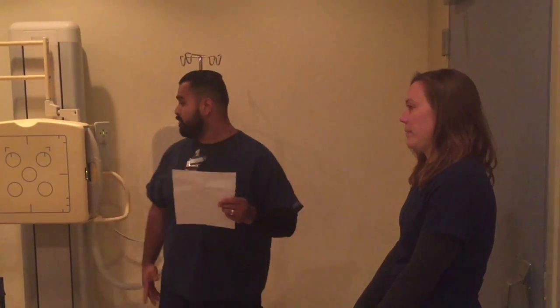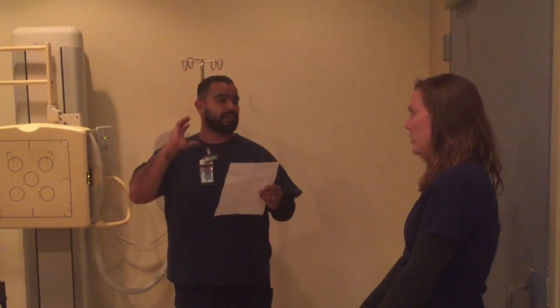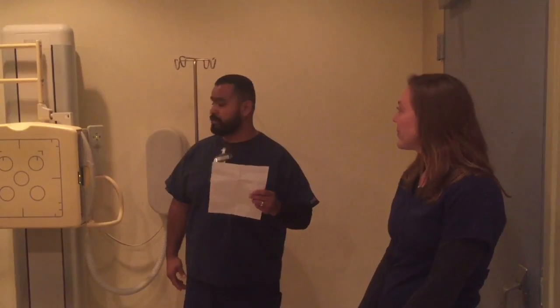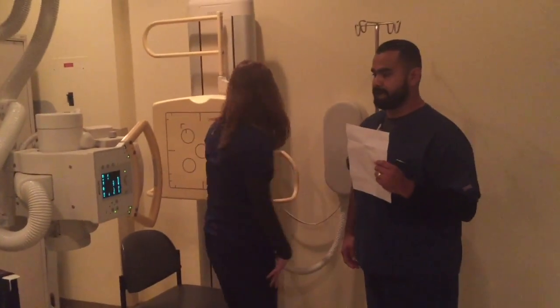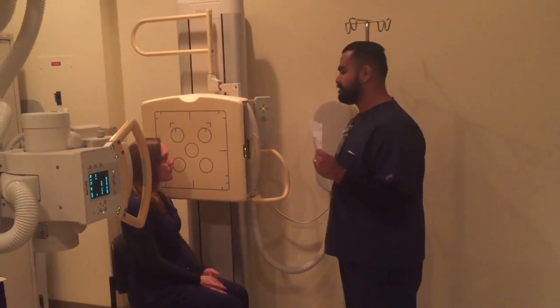Alrighty. So before I start, if you have anything in your hair, any dentures, partials, hearing aids, I'll have you take that out because it'll show up in the X-ray. I don't have anything. Okay, perfect. So for the first image, I'm gonna have you take a seat right here, please. Okay. Perfect.